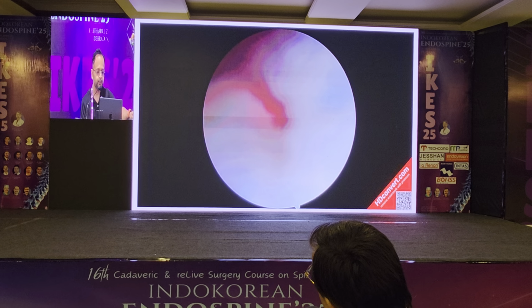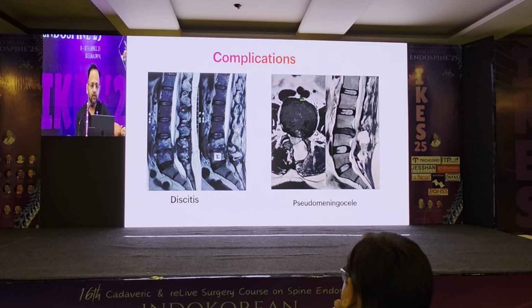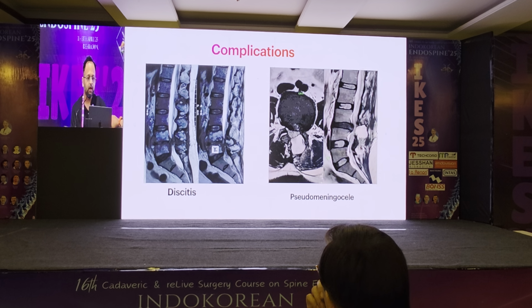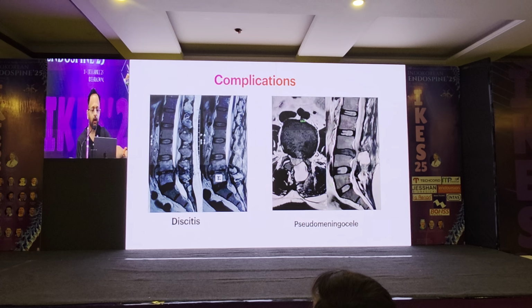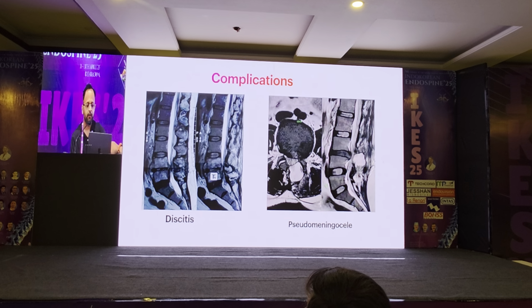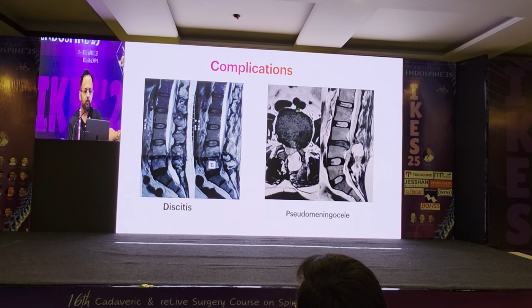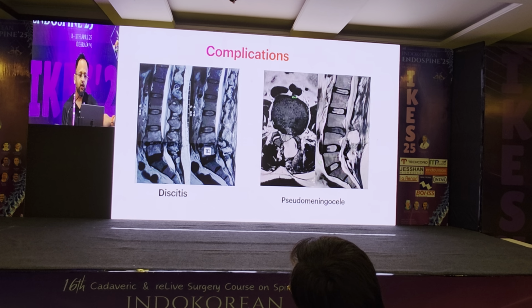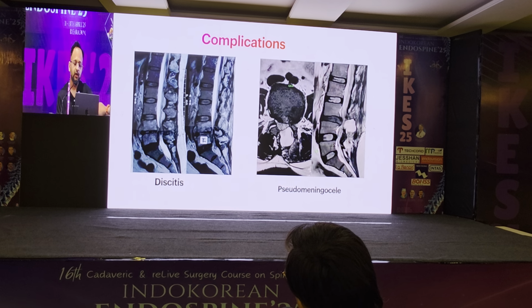progression of the recesses. And of course, coming to complications, it is discitis. Yes, of course, these complications should be avoided by good OT preparation and good pre-operative assessment, and still discitis is a nightmare for everyone. It tends to happen sometimes. As we have good techniques, now we can do endoscopic lavage of the disc spaces, but I always do something called fuse the spine. Micro instability is less, the patient comfortably walks back, let the antibiotics work, he'll be fine.